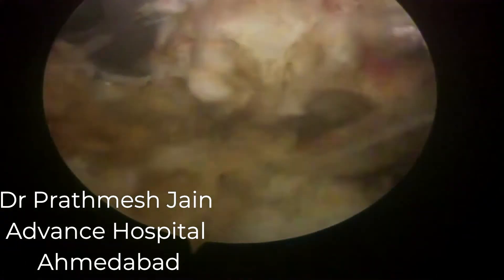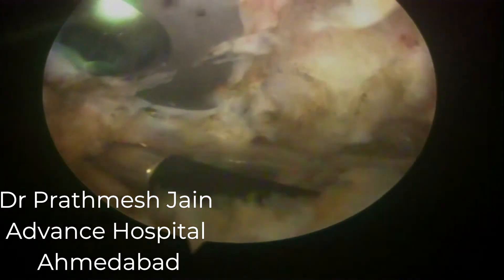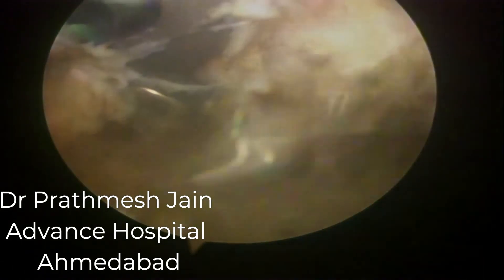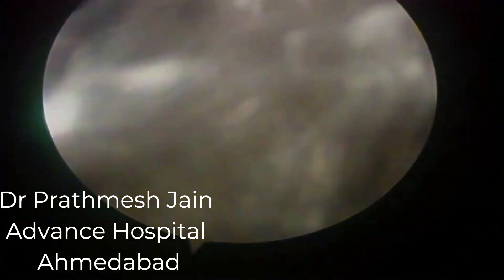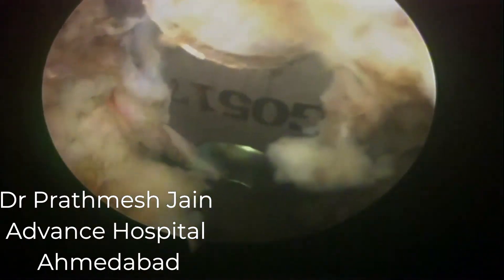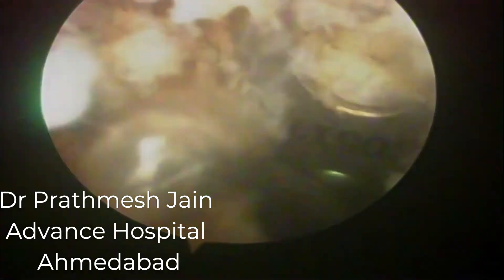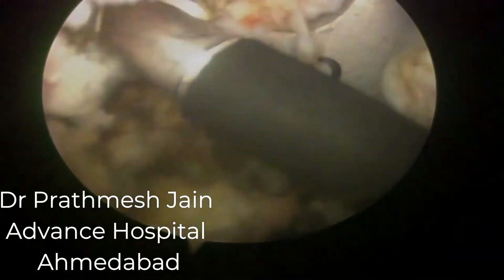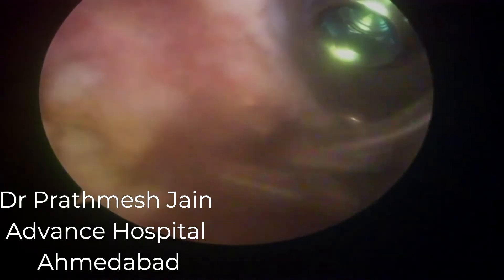The take-home message: whenever you have a Hoffa fracture, fix it very nicely and strongly, and start mobilization very soon. Delaying mobilization carries a high chance of stiffness with this fracture pattern. If stiffness develops, address it early. This was a late presentation — the patient came to us almost six months after the procedure — making the work very challenging. The actual range of motion was only 0 to 20 degrees and it was very difficult to even insert the scope into such a tight knee.